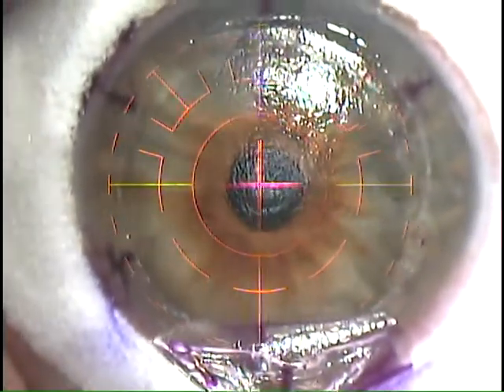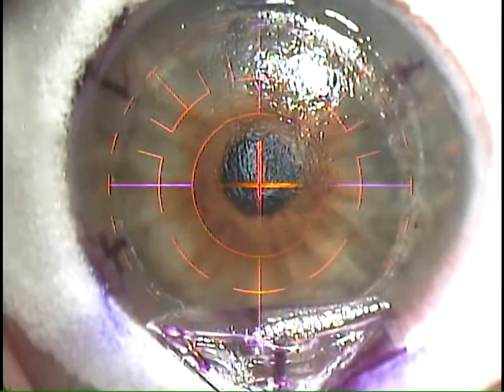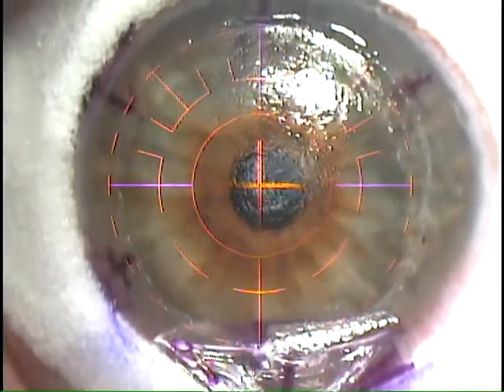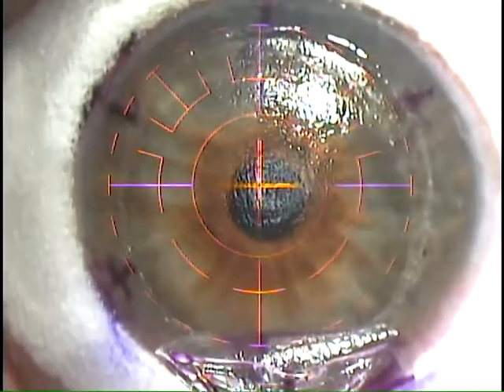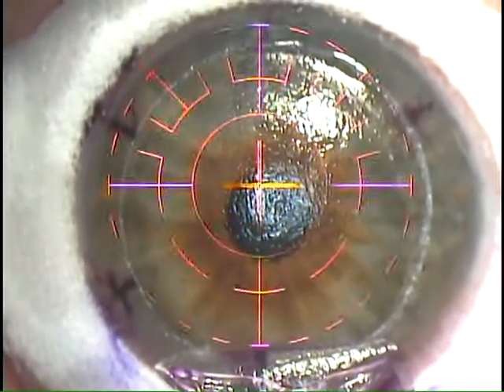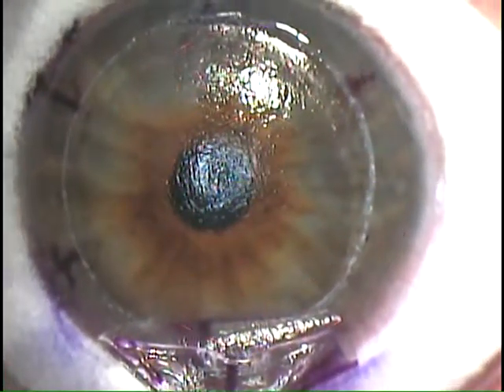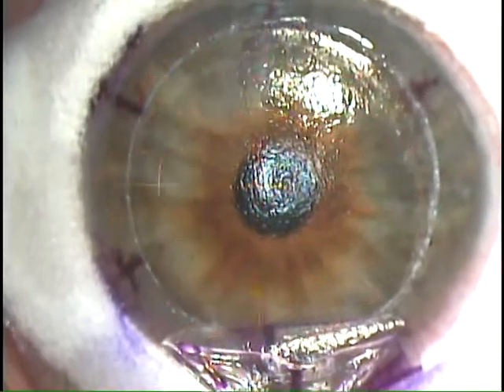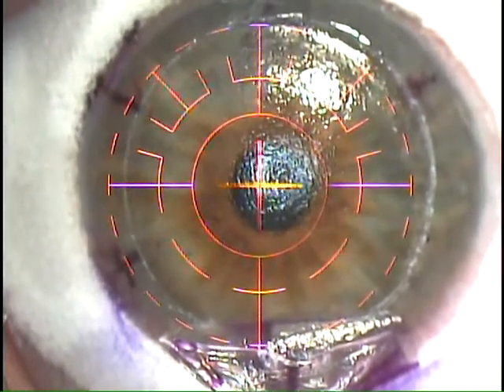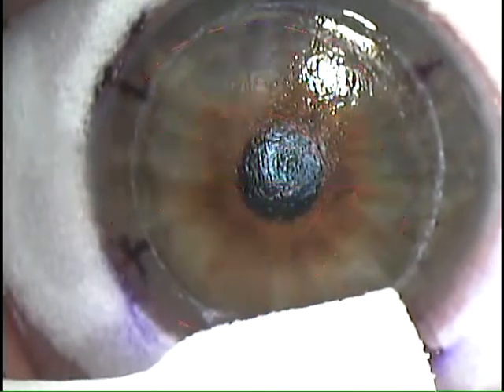Now we're going to proceed. 26 seconds, we're ready. We're going to protect this flap. Tone down the lights a bit. Now the tracker's on, and you can see the difference there. Watch — we're going to take it off. See? Now watch what happens as we get it there. Now it tracks. Then what I'm going to do is protect this flap at the same time.